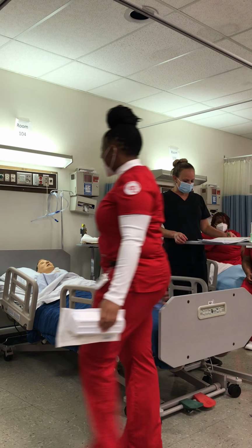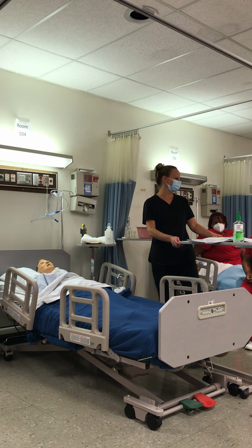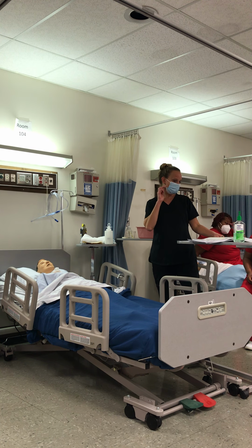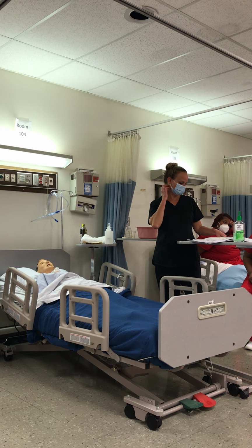All right, so NG2 placement. What do y'all think? A few people have got their sheets, right? And y'all are going to help me along, all right? But of course, with anything that we're doing, what do we have to make sure we have before we get started? Supplies. What else? Before we gather our supplies, what do we have to make sure? The information. We have to check the order.